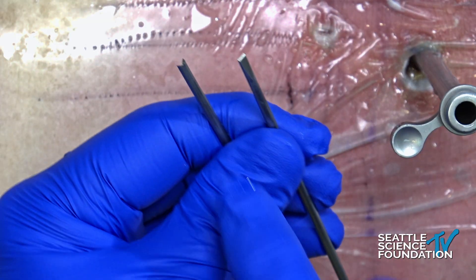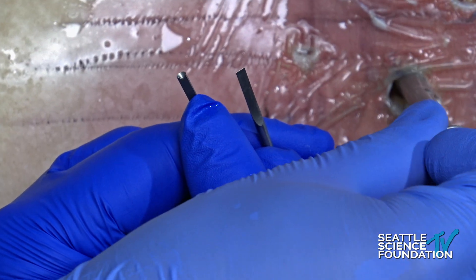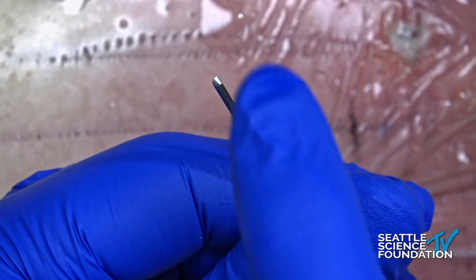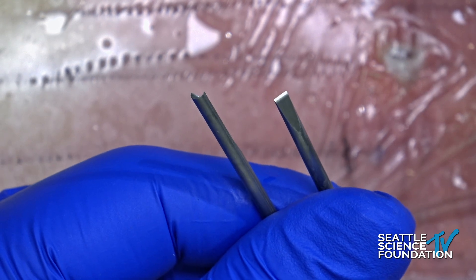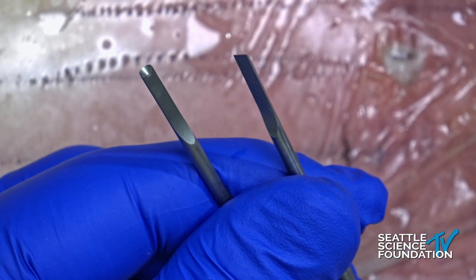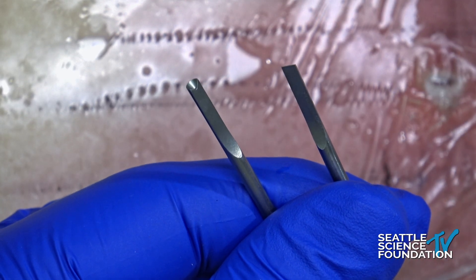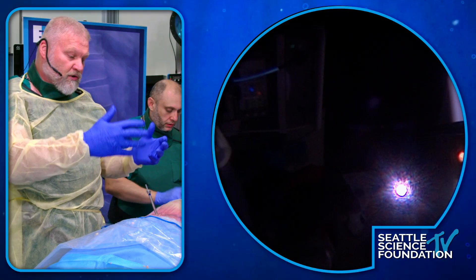You grab the bone rather than try to grab the squishy ligament, and the ligament comes with the piece of bone, which is nice. The gouge is good for over the top when you're trying to get the undersurface of the lamina contralaterally or the ligamentum contralaterally, because it takes little shoestring bits of bone off and peels the ligamentum right off the undersurface of the lamina. You can do that ipsilateral or contralateral and actually undercut your lamina.